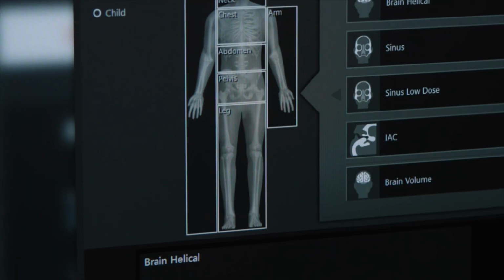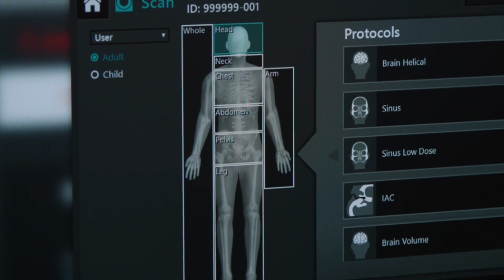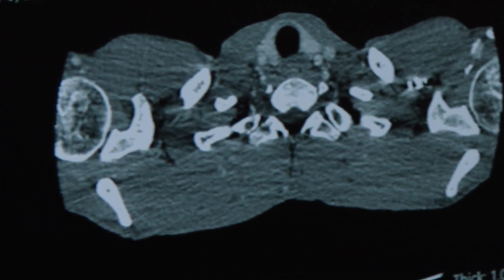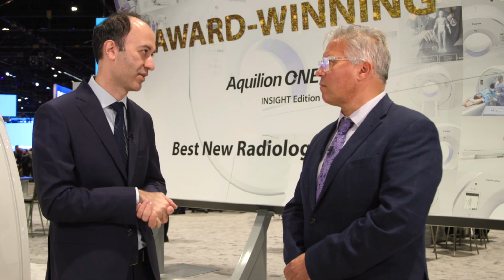Our colleagues in body imaging also use that technology. I think the PIQE reconstruction, that super resolution or high resolution, really makes a difference when you are scanning small structures which have inherent low contrast. For example, a small lesion in the pancreas. Our colleagues in body imaging were showing me it has improved their detection confidence.